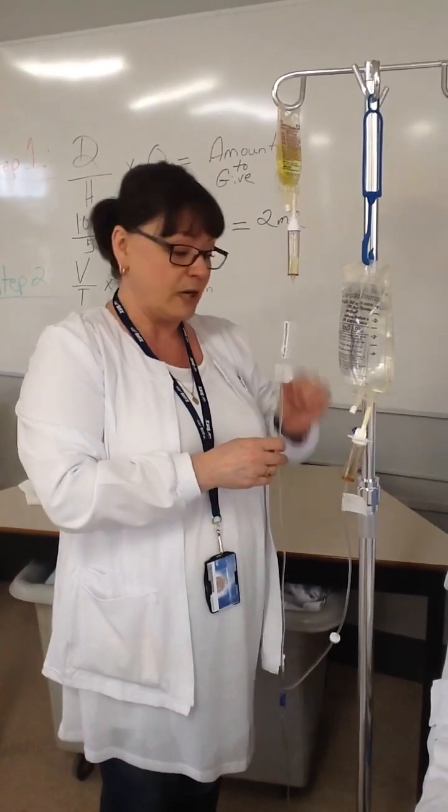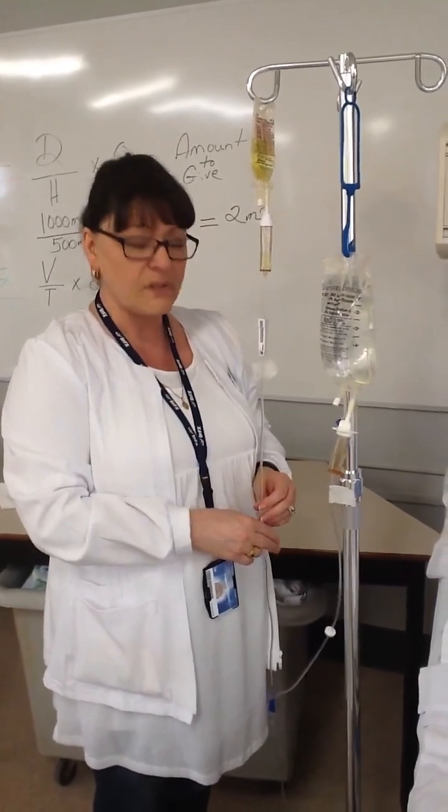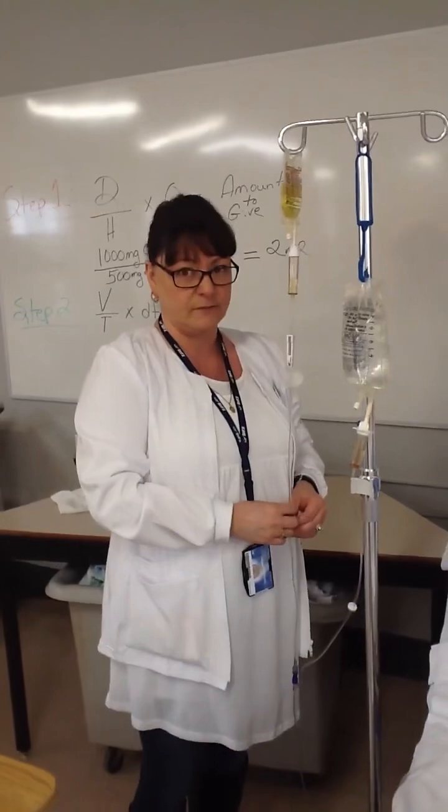Anytime that you come across tubing that has not been properly labeled, you're putting your patient at risk if it's exceeding that time limit of safety. So it's very fiscally responsible as well to label your tubing, okay?